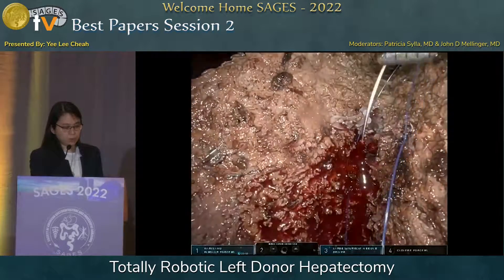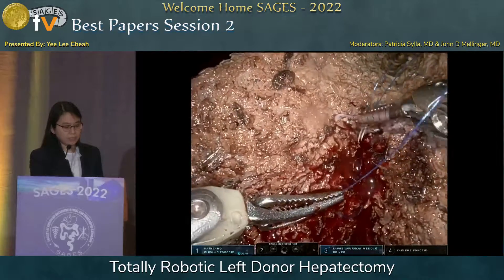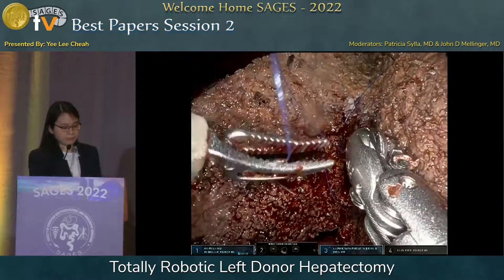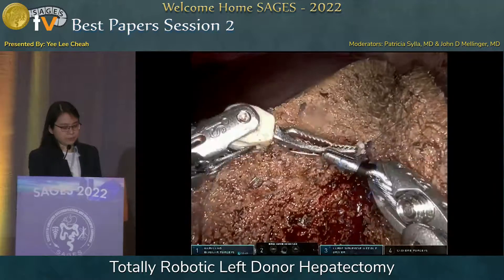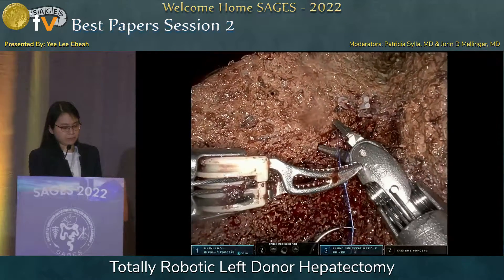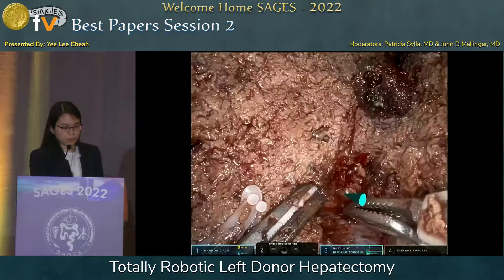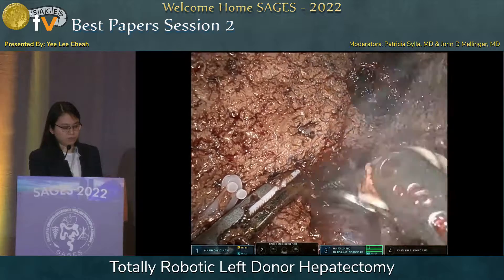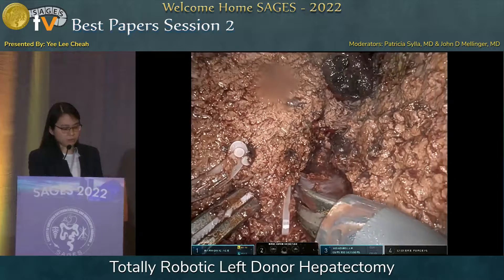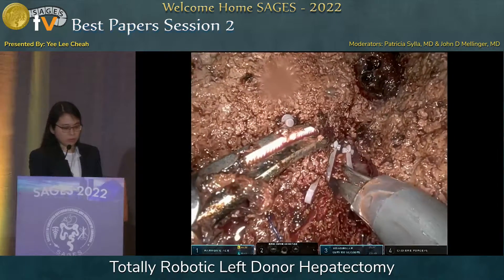Bleeders can be controlled with bipolar, or in this case, we can suture a small vein that's bleeding. Again, this is performed with no inflow and outflow control. As we proceed deeper into the transection plane, we reach the segment five hepatic vein — a good signpost to confirm you are on the correct side of the transection plane. The branches are encircled and usually clipped.